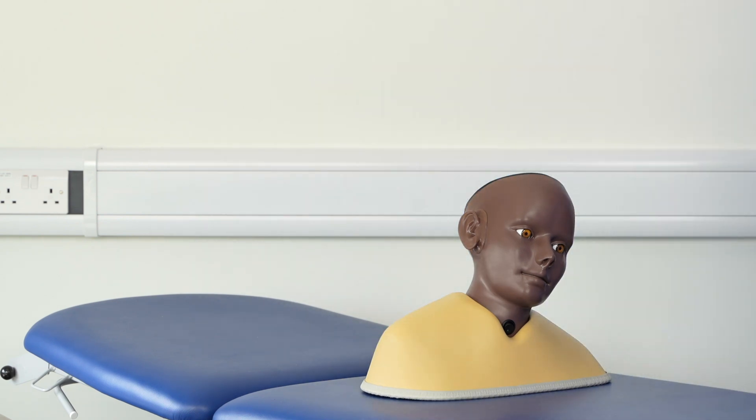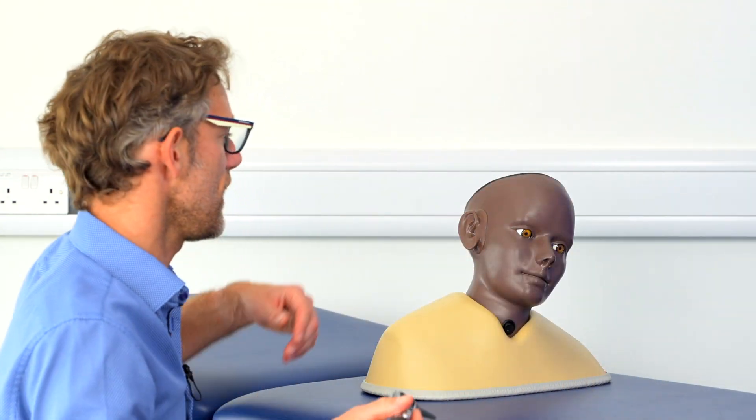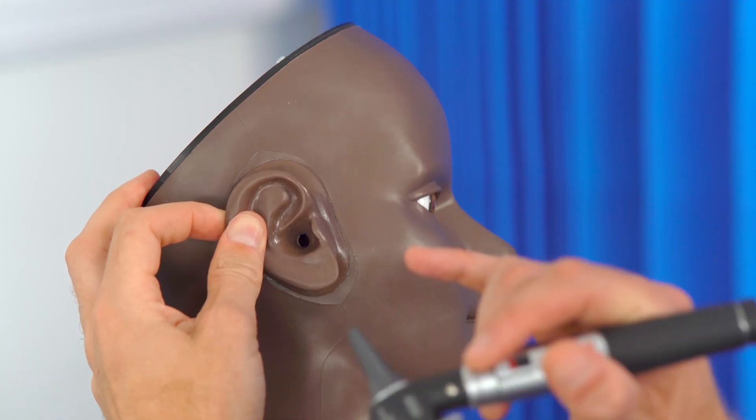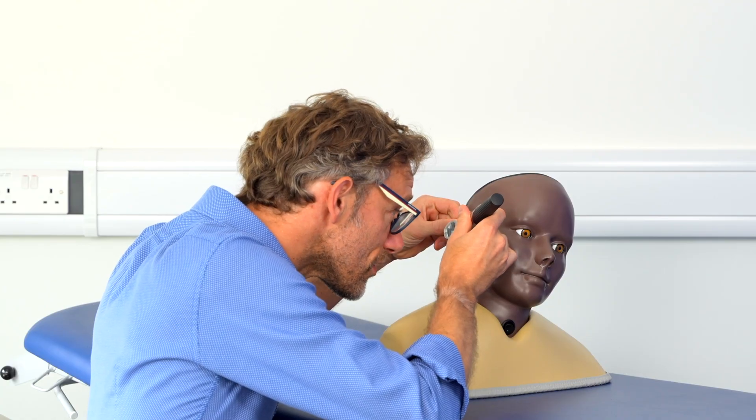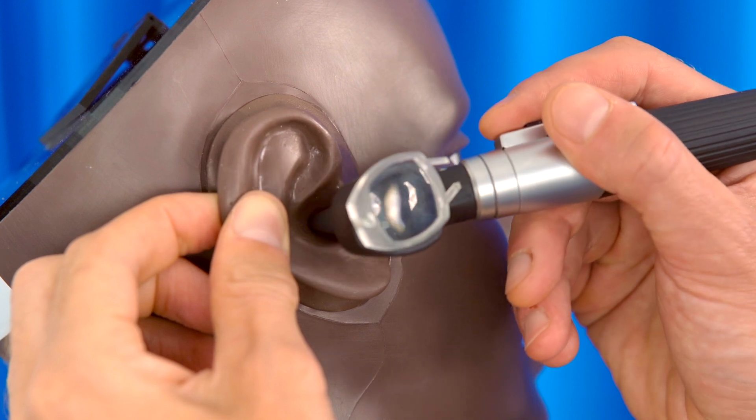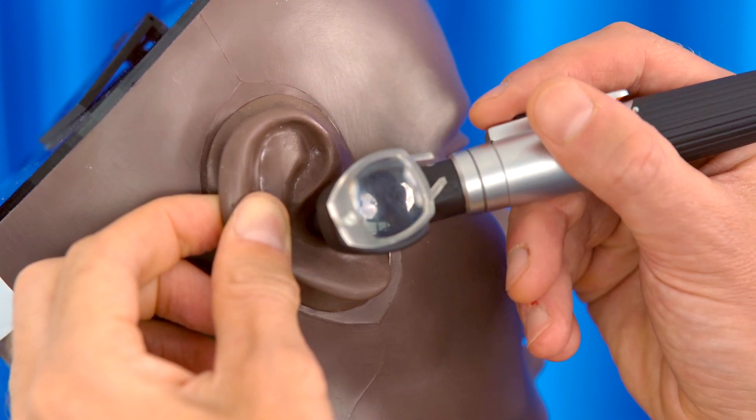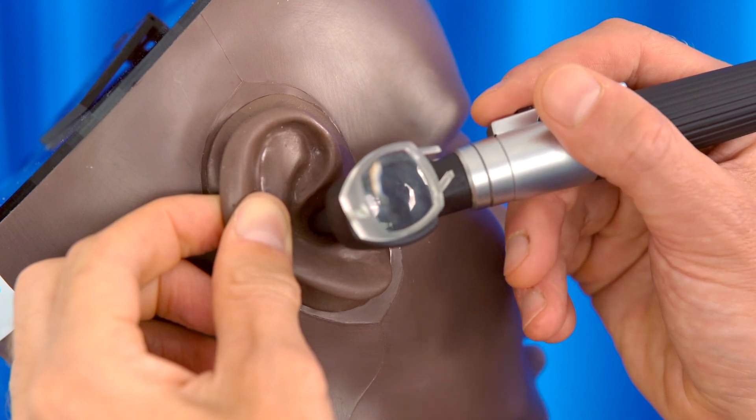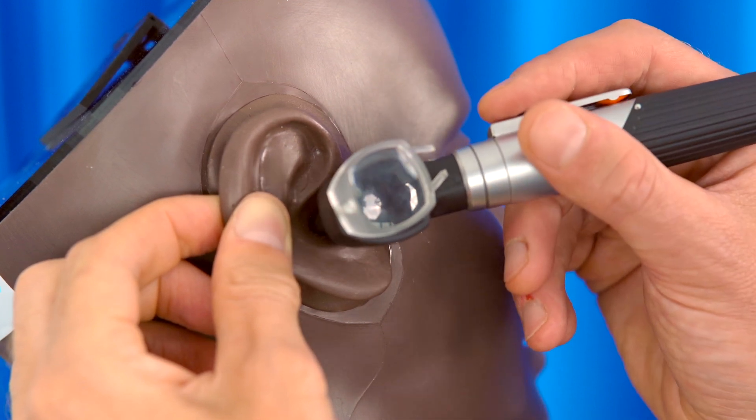I'm going to come back with the otoscope, and now we're going to have a look within the ear. So I'm just going to stabilize your face, pulling the ear back, and inserting the otoscope. So having a look inside, I can see a normal tympanic membrane. There's a normal light reflex. I can't see any fluid behind, no evidence of scars. There are no problems with the ear canal.